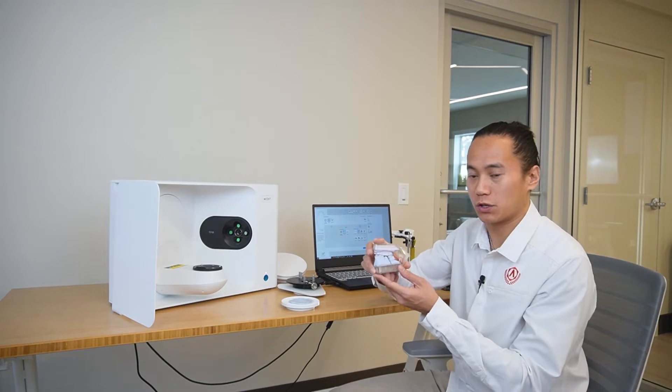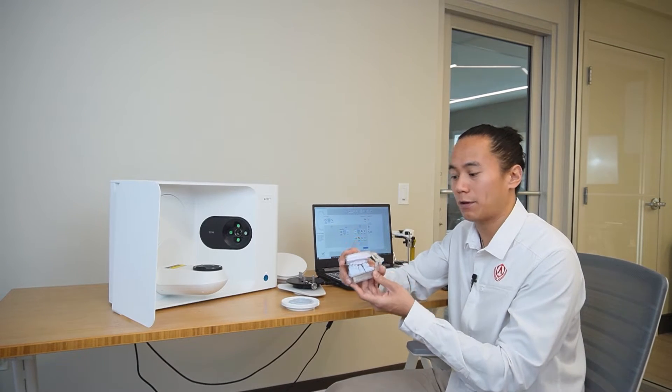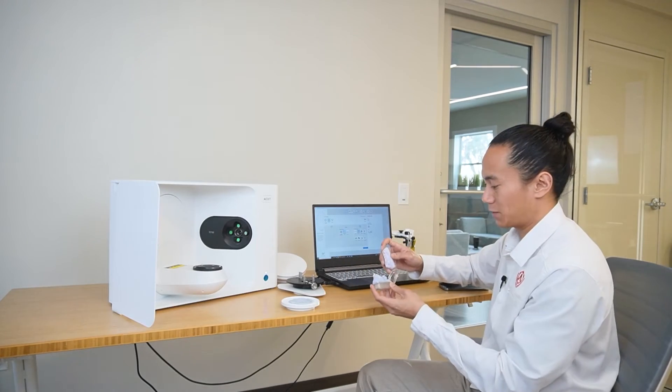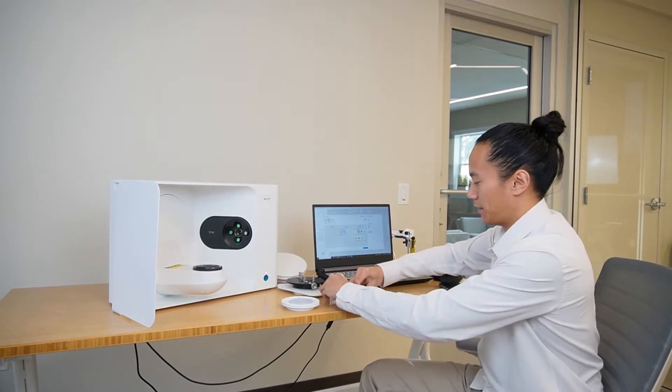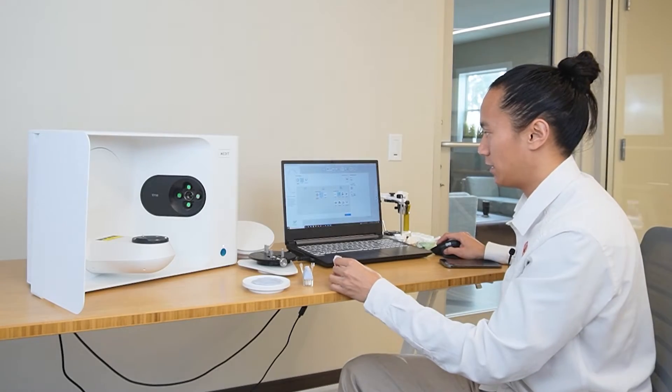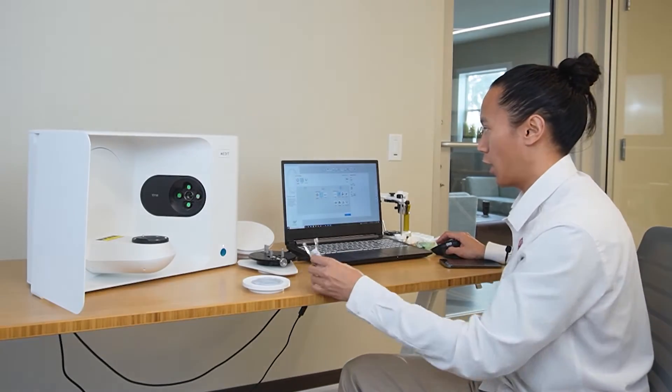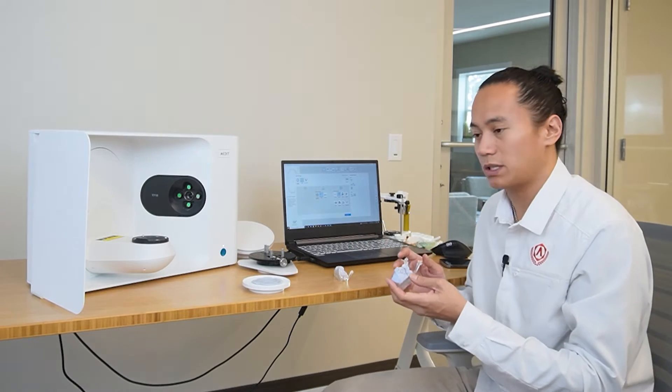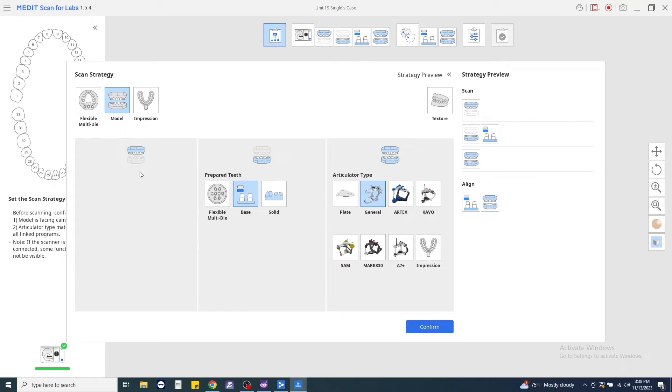So at this point, we're going to make sure that we take a look at the model that we have and make sure that we set up the strategy accordingly. The antagonist is pretty straightforward. So I'm going to go ahead and just separate my models. So we have our opposing scan. Now we're going to go to our prepared tooth. We have our base and we have our prep die. So this looks pretty good. We don't need to do the flexible multi-die right now. So I'm just going to leave it in as base with the removable die.